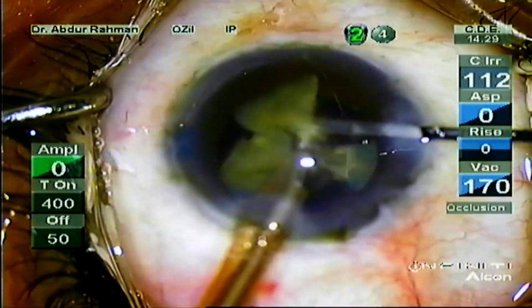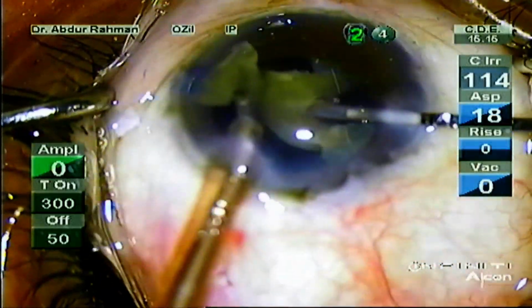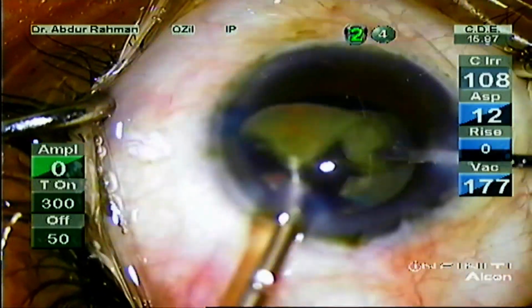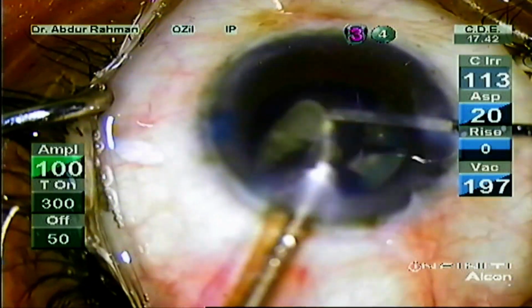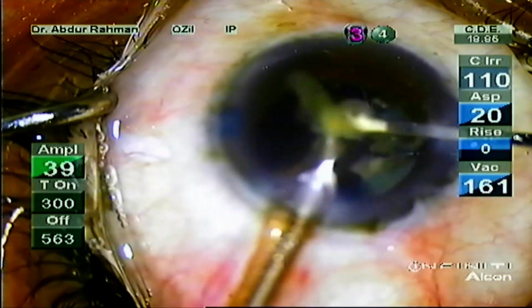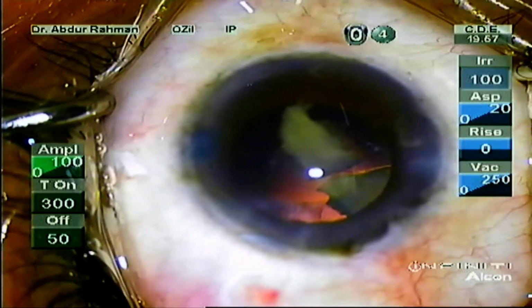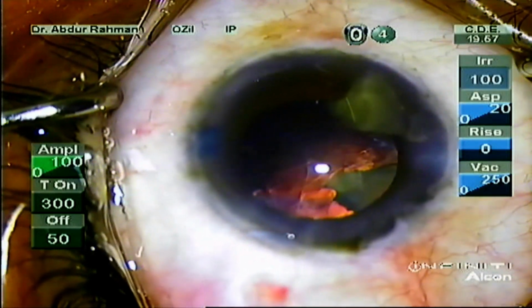In this bag, there is no protective layer of epinucleus or cortex on the posterior capsule. So be careful while emulsifying these chopped pieces, because at any time the posterior capsule might come forward and get caught by the phaco handpiece and cause a PCR. To avoid this, I am again replenishing the OVD and pushing the posterior capsule posteriorly.